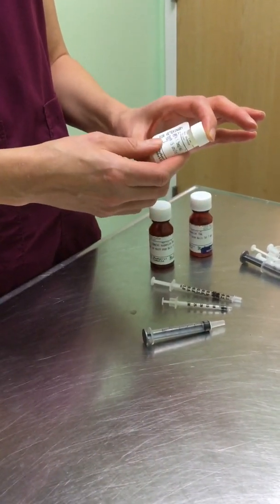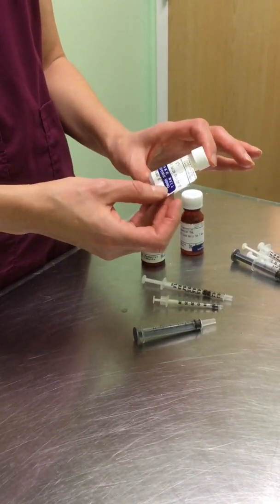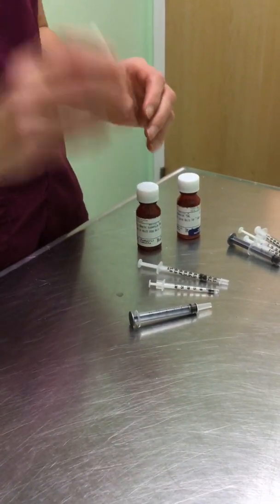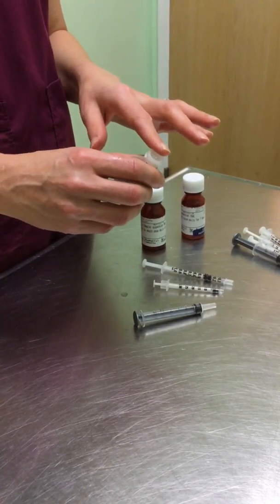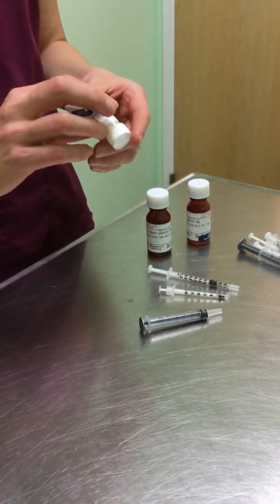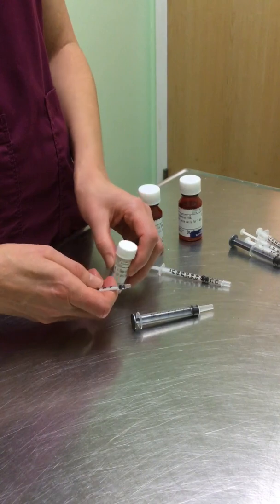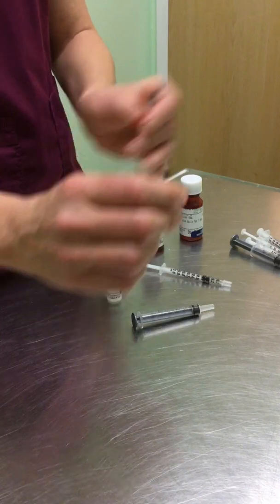The directions are to give 0.05 mLs, which is in parentheses 5 units, by mouth twice daily for 10 days, and shake well. Please make sure if you do get a bottle that says shake well on it to make sure it actually is shaken super well. A lot of these suspensions have actual sedimentation on the bottom where some of the medication may concentrate. And if you don't suspend it by mixing it and shaking it really well, you may not be giving the correct amount of medication to your pet. So I'm giving 0.05 mLs. I want to be very clear that that is very different from 0.5 mLs.